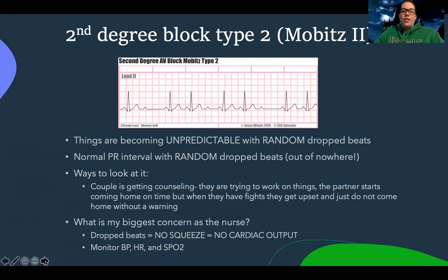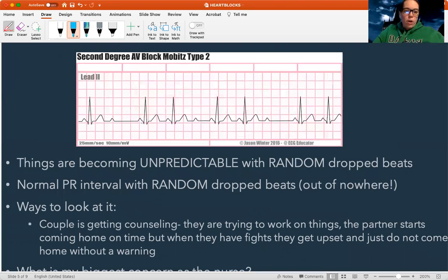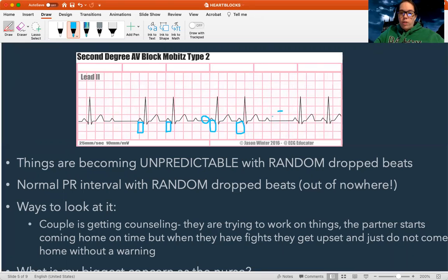Next is second degree type two. This is different in that we're going to look at the PR interval again. This one actually has a normal PR interval — it's not even the size of one box, it looks normal. But wait — there's a P wave with no QRS. So there's a random dropped beat. Then a normal PR interval, normal, and then another dropped beat. So in second degree type two, we have a normal PR interval but just randomly dropping beats out of nowhere. This is more serious.